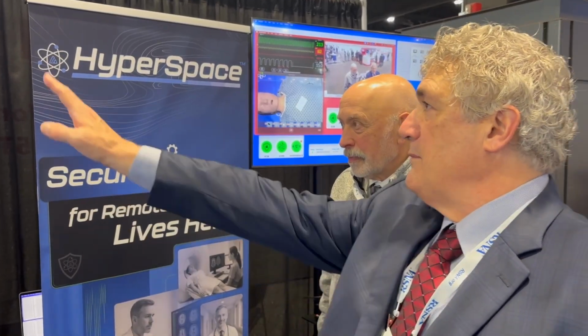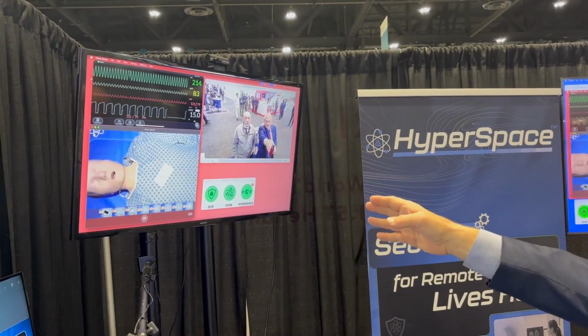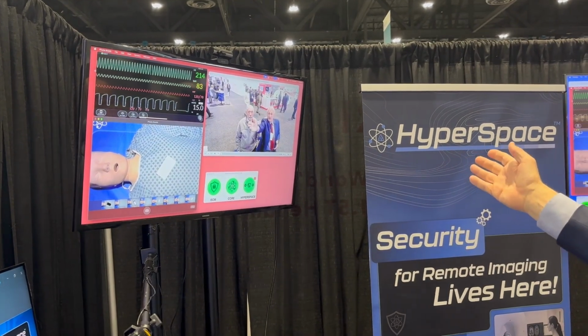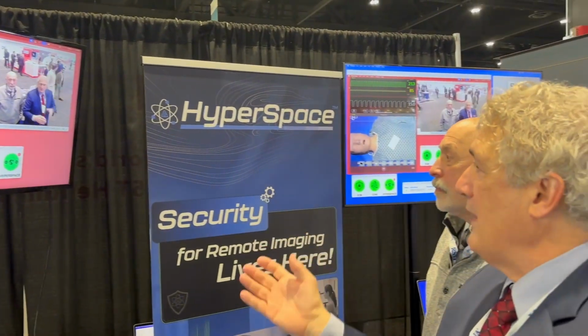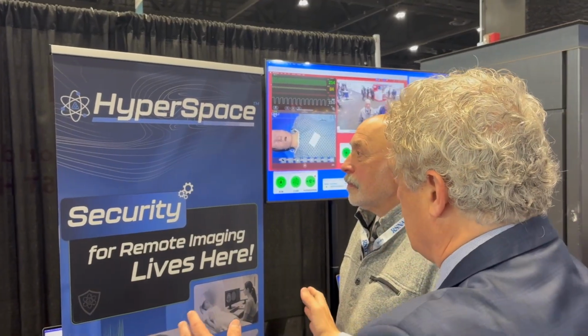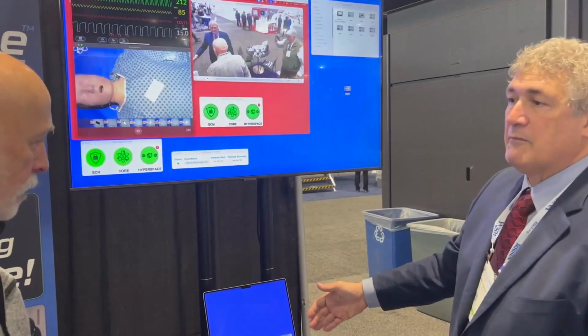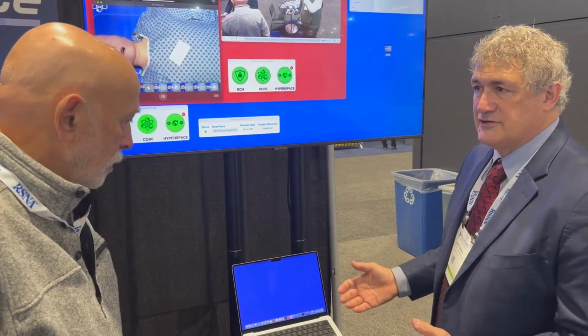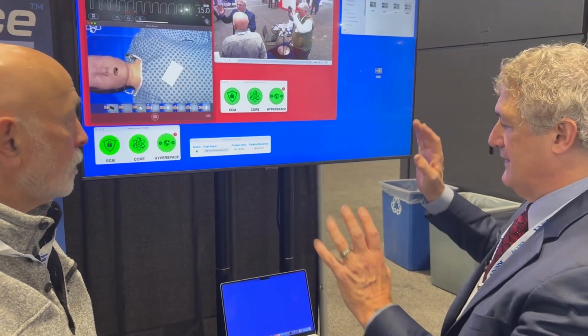And what I'm showing up above is this heartbeat type monitor, an image of the actual patient, and an image of the operating room, which is us up here in the window itself. So all that is being transferred across the network, across the HyperSpace network, and it's being controlled over here on this side by a remote operator. So this is where your remote radiologist would be. You would have their screen, they would be in their office or their home, wherever would be the case.